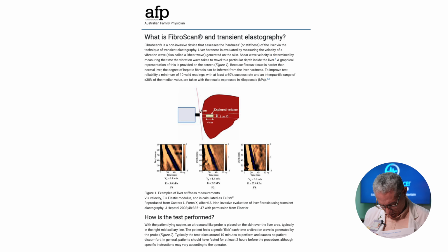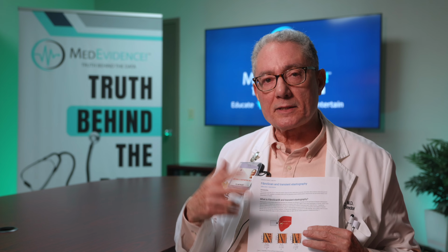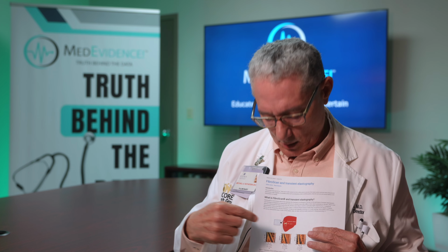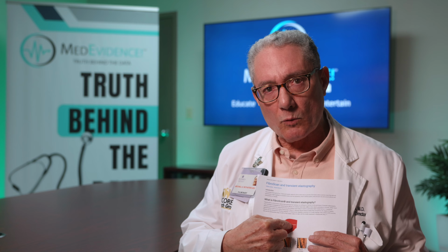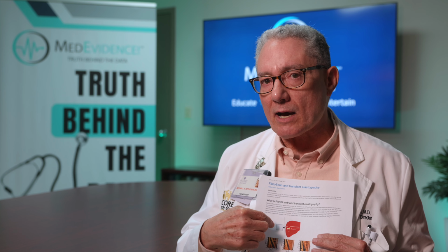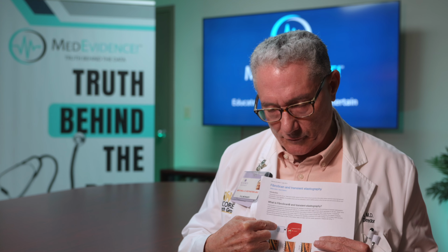We place the probe against the chest wall next to the liver, and we use the probe to create a pulse vibration. That vibration travels into the liver and then bounces back. There are two aspects to that vibration waveform that we're looking at. One is how quickly the waveform comes back from the liver, and the second is how much of the waveform comes back from the liver.